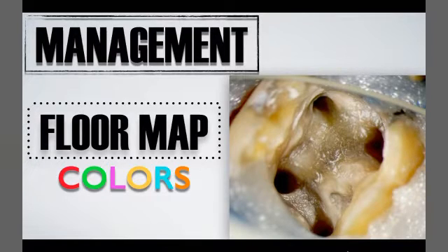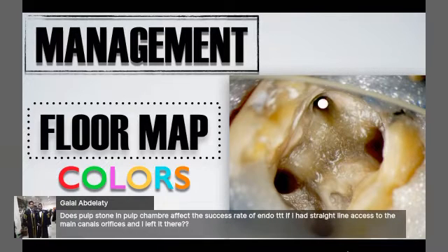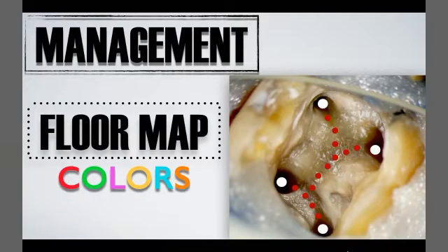And inside this floor, we have a map. This map is usually dark lines connecting the orifices. So we have a guide, and hopefully this guide will lead us into the root canal orifices. So we have to follow this guide, the dark lines connecting our root canal orifices, and then we can proceed into the root canal system.